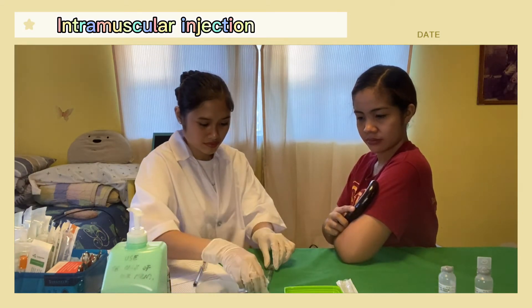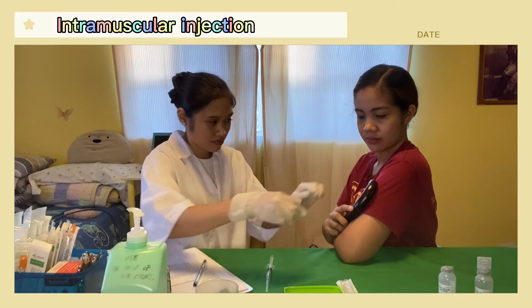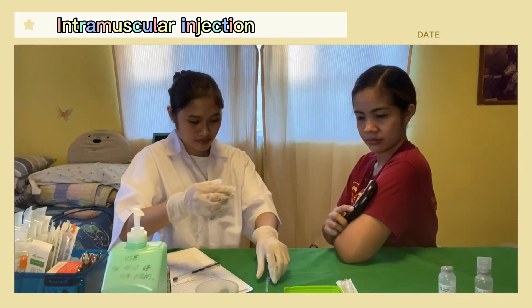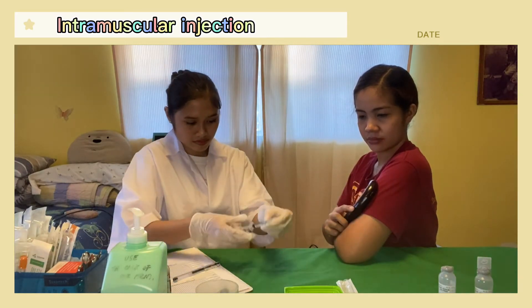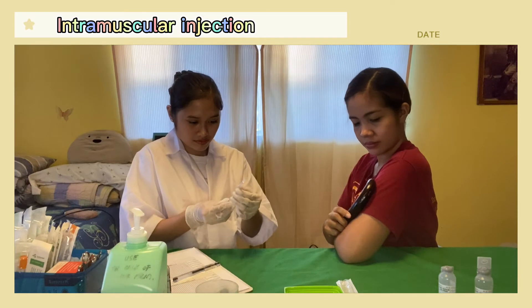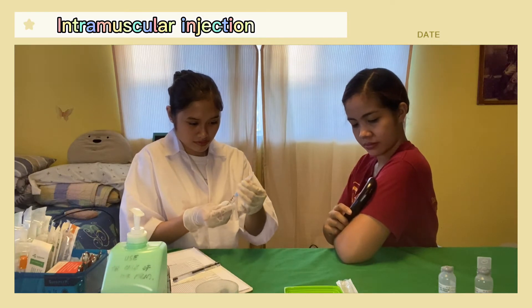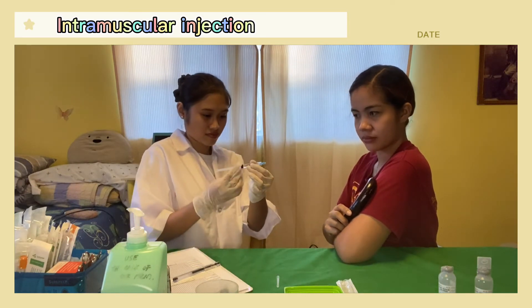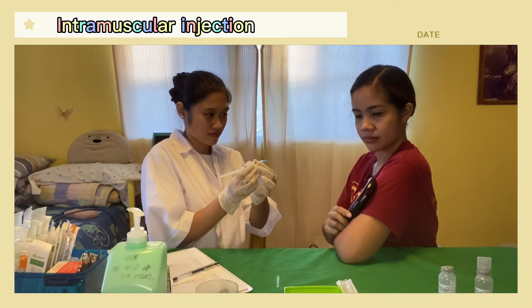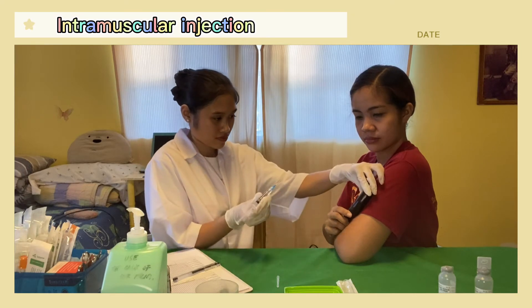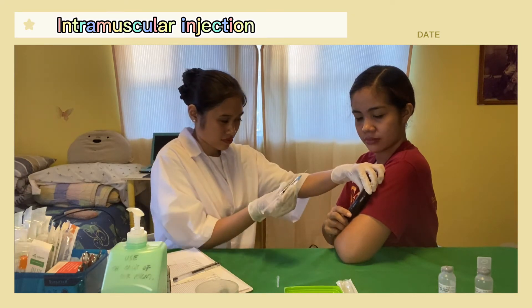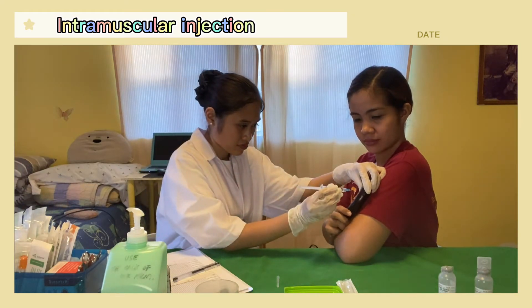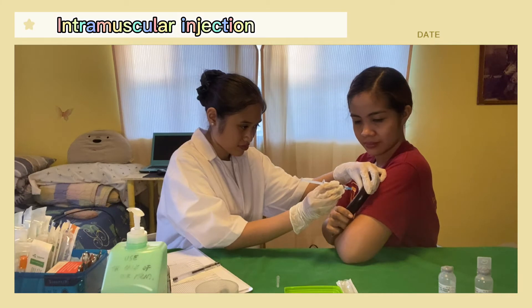Now inspect the skin for bruises, inflammation, edema, masses, tenderness, and sites of previous injection. Then uncap the needle using the non-dominant hand. You may hold the syringe between the thumb and forefinger of the dominant hand like a dart.